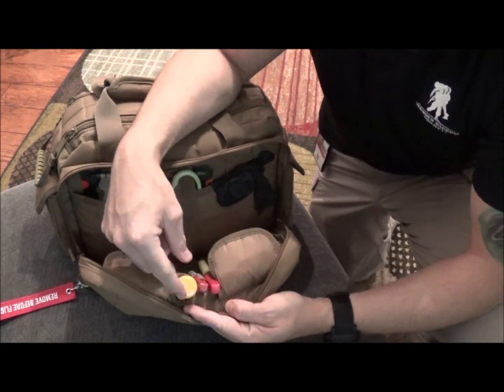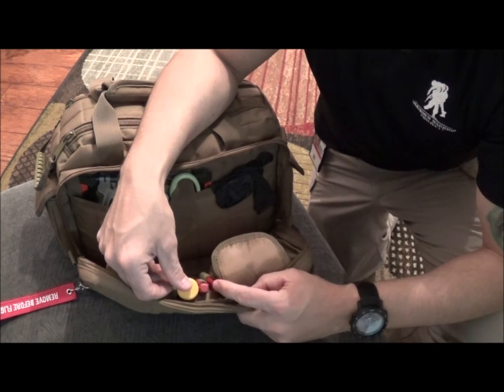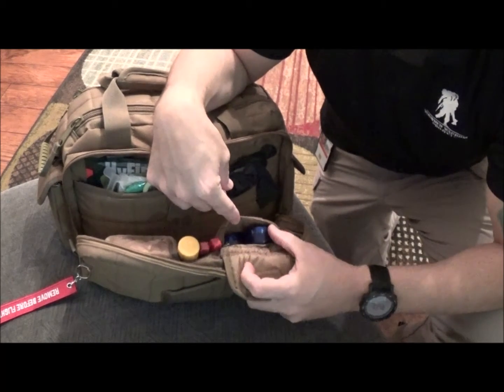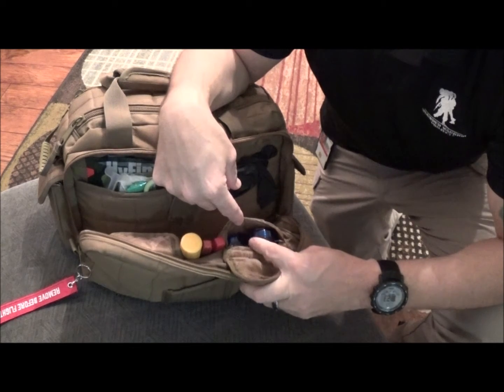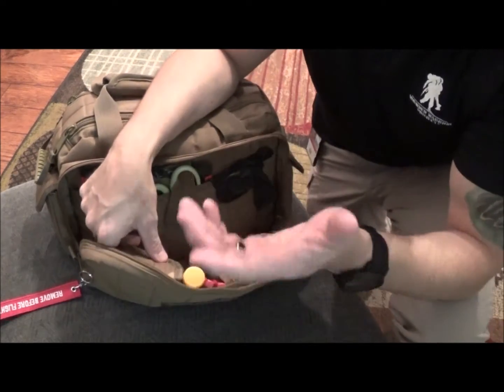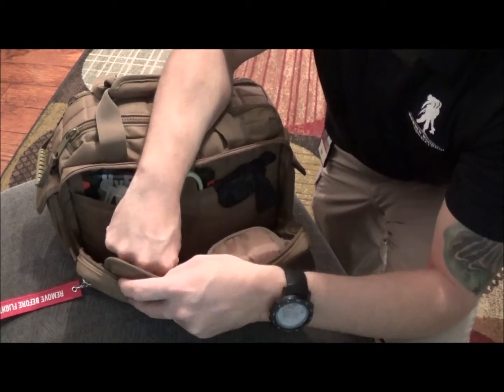Also have an EpiPen here. I have two chest needles. I have a 10 gauge and a 14 gauge. Inside of here, just got some regular medicine, some aspirin, some Tylenol. I do keep the chewable aspirin, the non-protective coating though, the ones for the heart attack victims, okay? Or if you suspect somebody's having a heart attack, just make sure that they're not allergic to aspirin before you give anybody that.